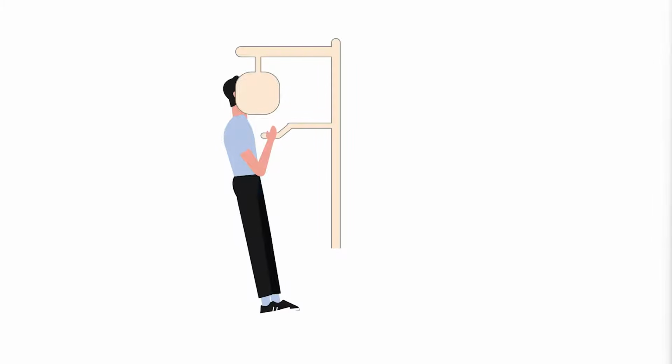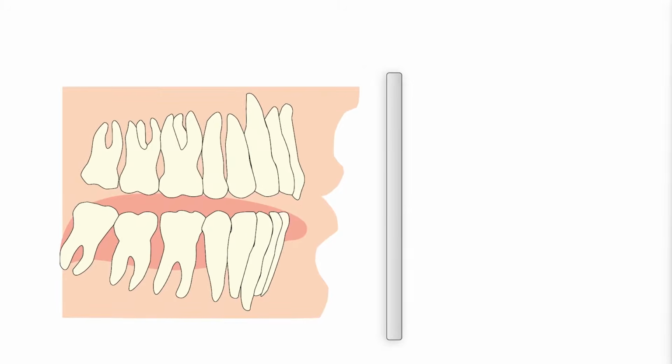Let's ask John to bring his feet a few inches forward. His back leans back a little bit. In this position, if he releases his hands, he might fall back. John's back is upright and he is not slouching. This gray rectangle will be the location of the sensor or the X-ray film. And John's face is in the right position for radiography.